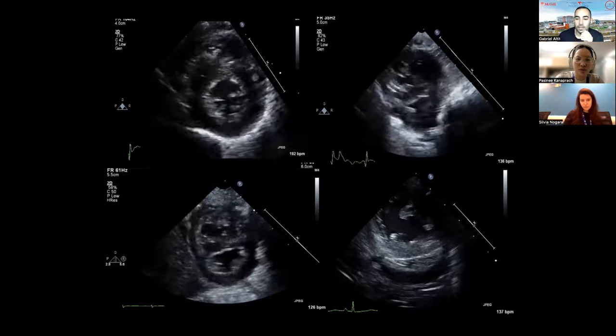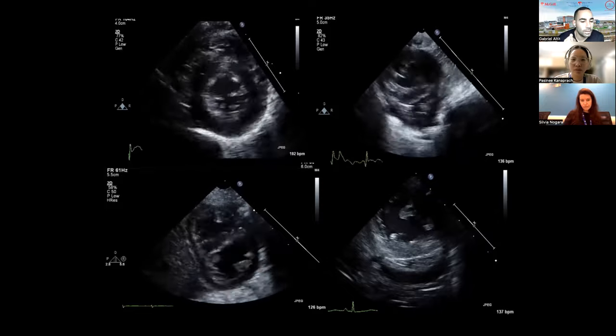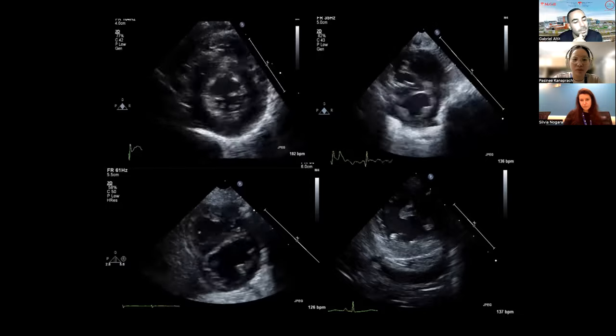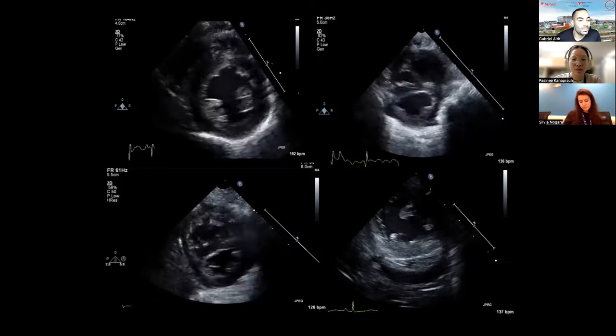Other things about that: the shape of the ventricular septum is assessed during which part of the cardiac cycle, systole or diastole, typically? It's a trick question. You can assess it in any part of the cardiac cycle if you wish. It's just going to give you different types of information.